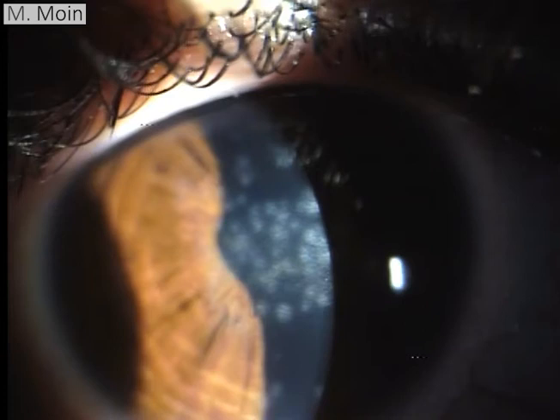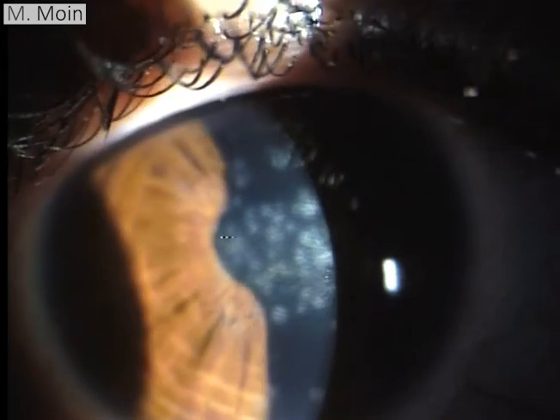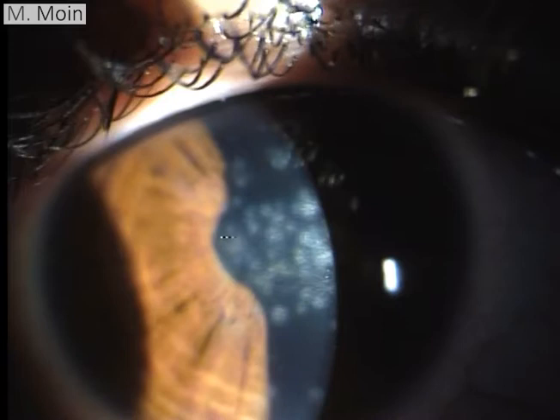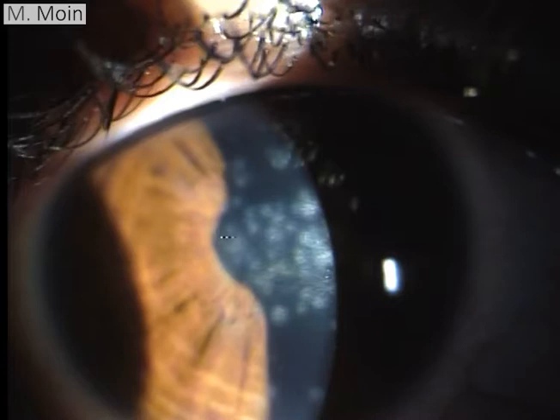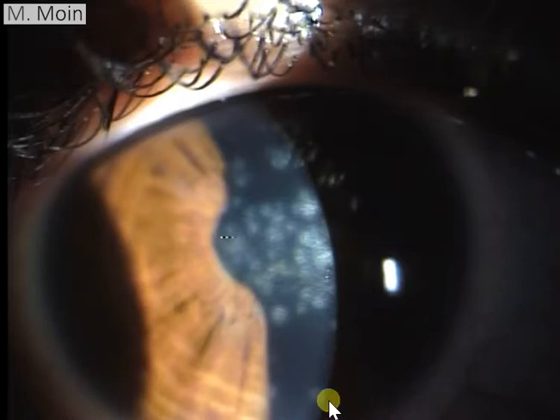Welcome to this video of the anterior segment, in which we are going to show you a case who had a history of acute onset redness — intense redness which lasted for a week or two — followed by a blurring of vision. And then on slit-lamp examination, this is the finding which we're seeing.